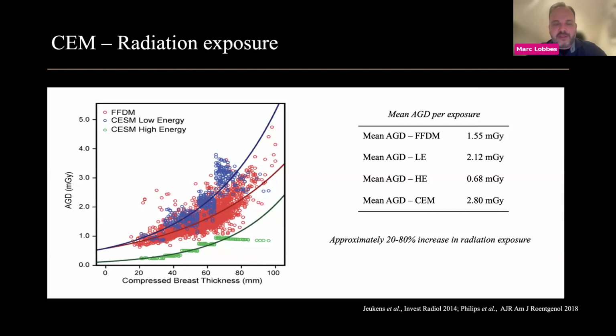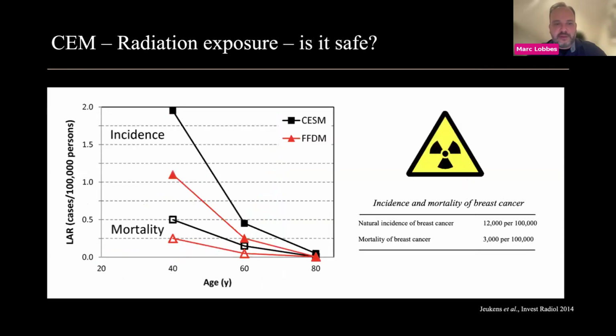And it depends a little bit on the population that you study, the settings that you use, and what kind of generation of system that you use. Because, of course, the technical developments are not standing still. They improve even at this area as we speak. Now, you should also ask yourself, is this harmful? You should still remember that mammography has a very low radiation exposure. And even if we increase it by 80%, that still means that it's a very low radiation exposure.